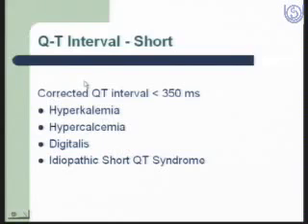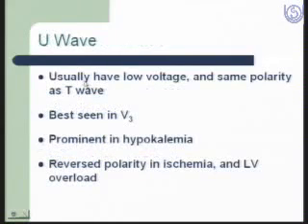Now U waves are low voltage deflections and have the same polarity as the T wave. They are best seen in V3 and become very prominent in hypokalemia. Reverse polarity of U wave may be seen in ischemia and patients with LV overload.